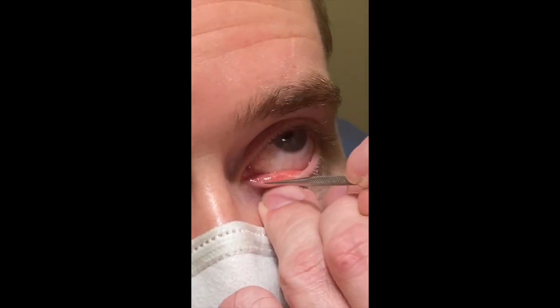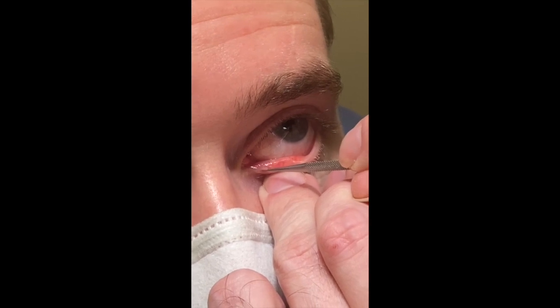The left eye is done similarly except in this case, obviously, approach from the left side. This is a closer up view.